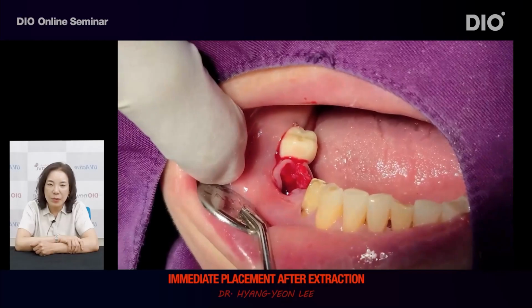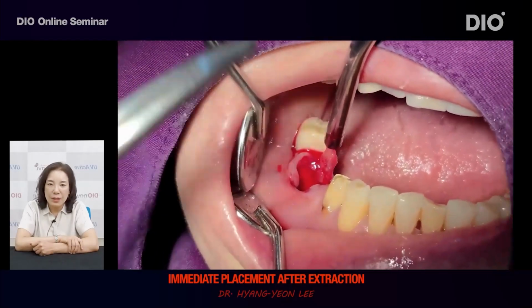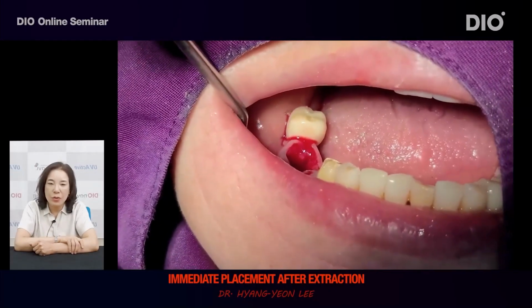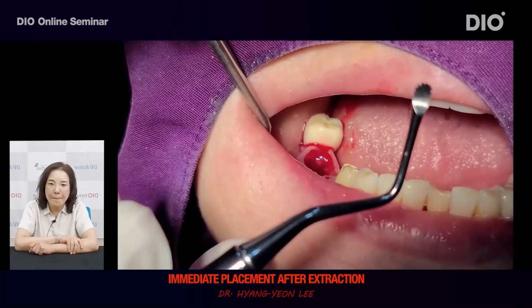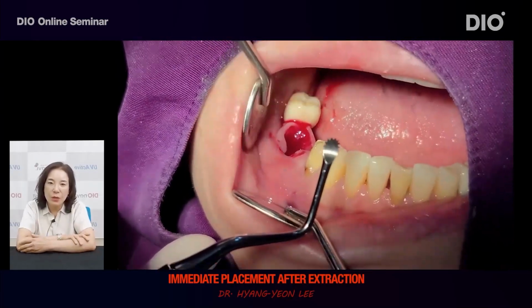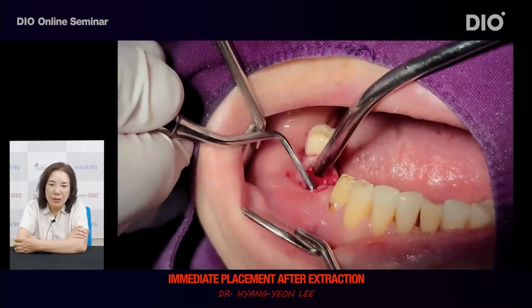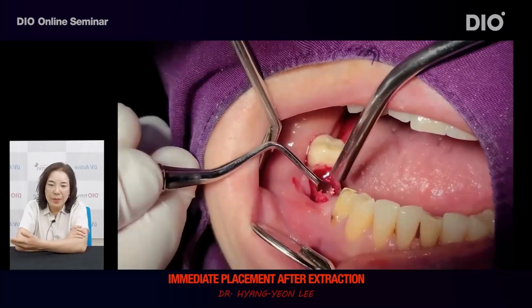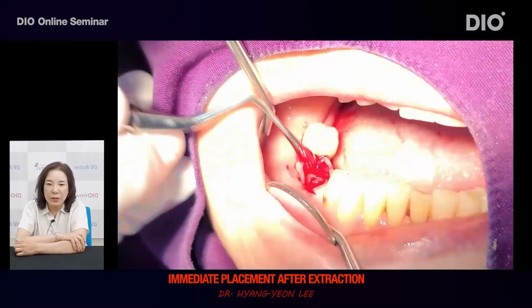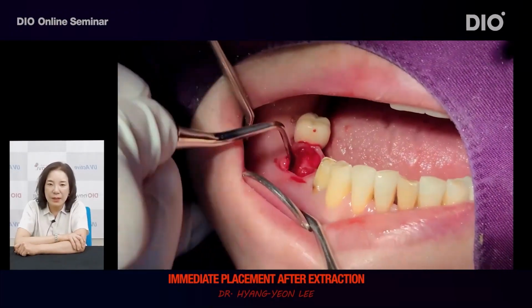When all of these are removed, inflammation becomes visible. Inflammation will be curetted. If you examine the curette closely, it is shaped like a saw-toothed wheel. It is very helpful in scraping out the inflammation tissues. It performs much better than simply rounded curettes.